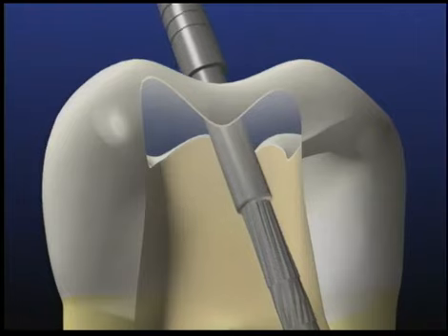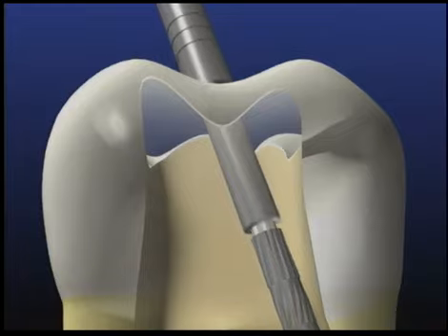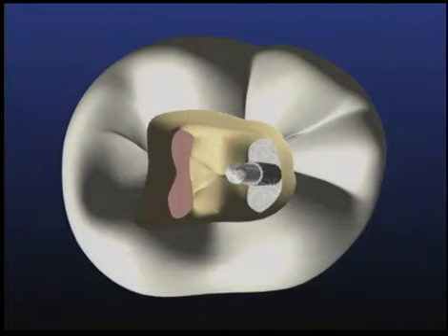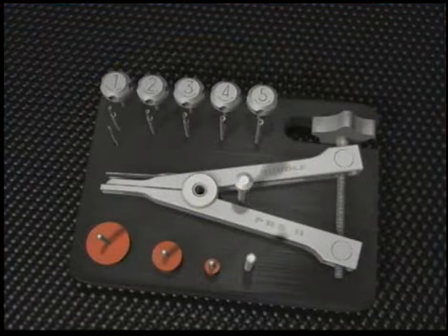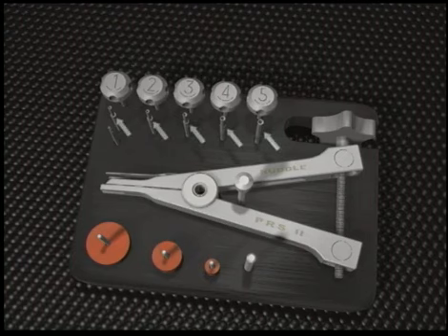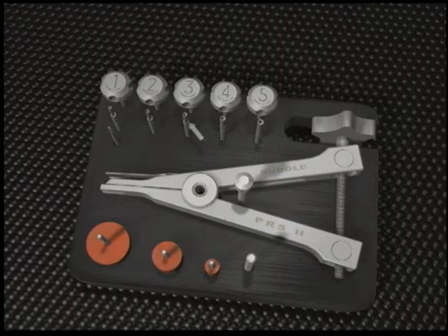Attention is focused on the proper trephine post alignment during the drilling phase. The trephine progressively machines down the coronalmost aspect of the post in preparation for the next step. There are 5 tubular taps whose internal diameters range from 0.6 to 1.6 millimeters. Each tap is precisely paired to correspondingly numbered trephines. As an example, using a number 3 trephine dictates the selection of a number 3 tap.